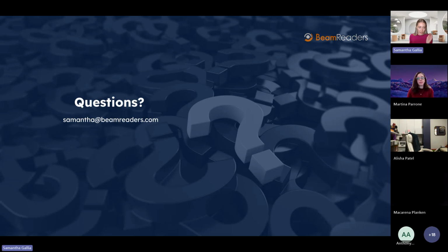Great question. Obviously, really enmeshed in what we talked about today. But I would say the standard of care is personalizing CBCT scanning to each individual patient. So we should not be blanket taking CBCTs really for any purpose. It's going to be with each specific patient. Is there information that I can't get from my routine 2D imaging that would change my treatment plan? That's the bottom line.